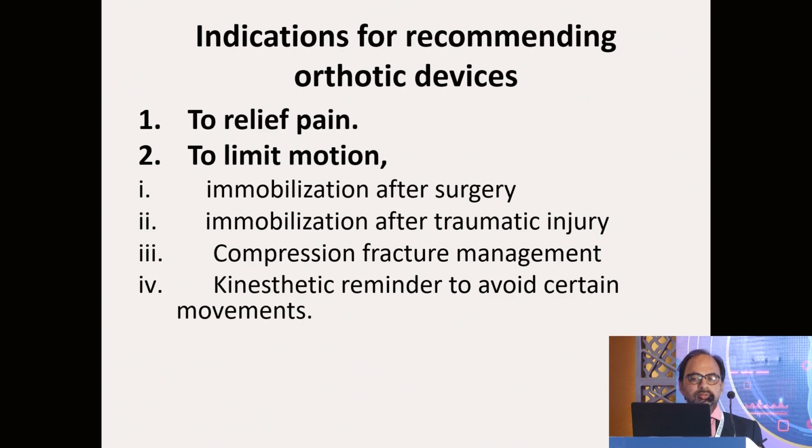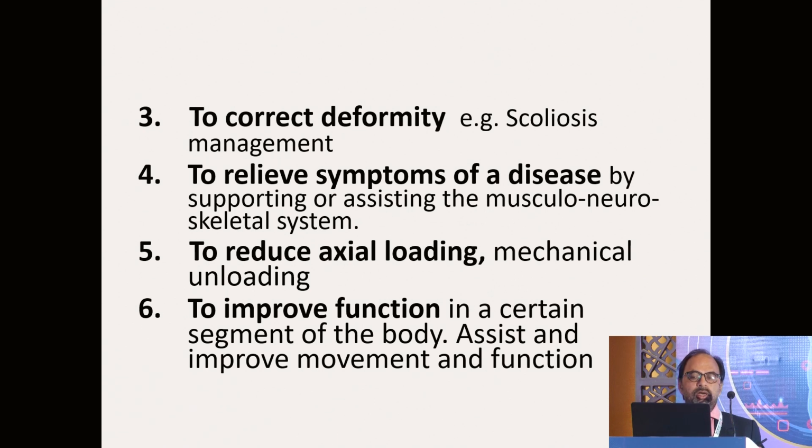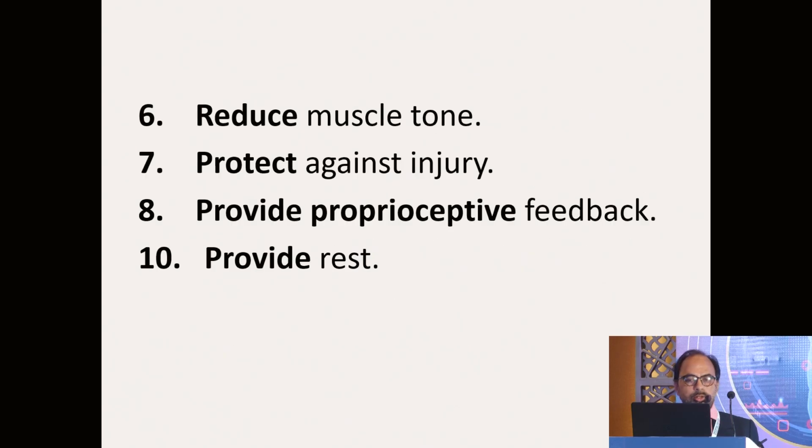So what are the indications for recommending orthotic devices? To relieve pain, to limit motion like immobilization after surgery, immobilization after traumatic injury, compression fracture management, kinesthetic reminder to avoid certain movements, and to correct deformity like scoliosis management, to relieve symptoms of disease by supporting or assisting the musculoskeletal system, to reduce axial loading, to improve function in a certain segment of the body and assist and improve movement and function, reduce muscle tone, protect against injury, provide proprioceptive feedback and provide rest.